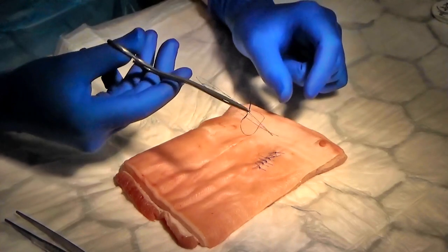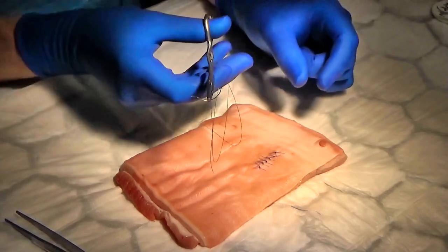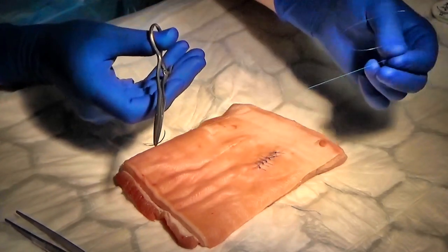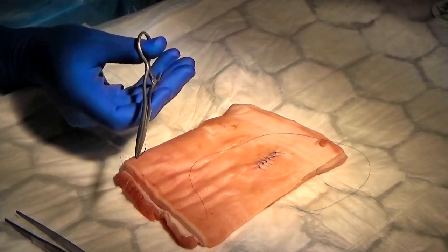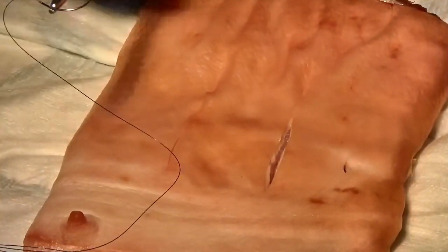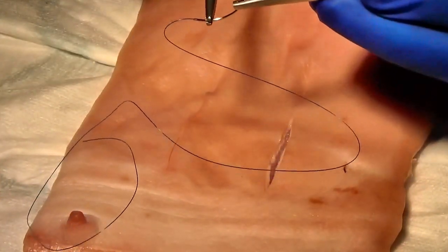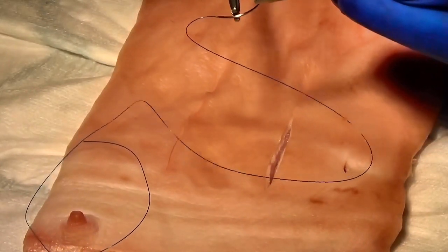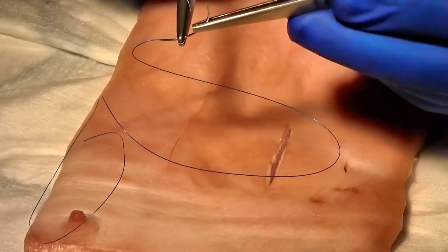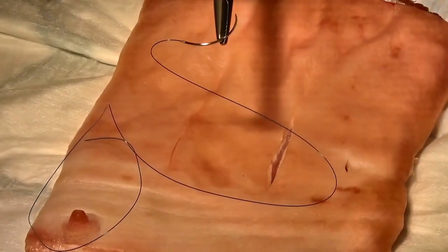So you notice that the thread has got what's called memory. It still thinks it's coiled up in the packet. So just stretch it. That makes it much easier to handle. You can, if tissues are very hard, put it there.